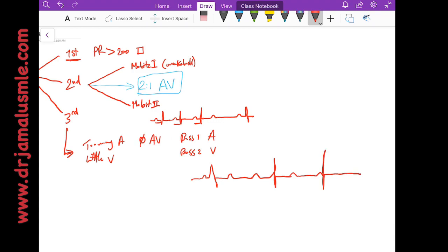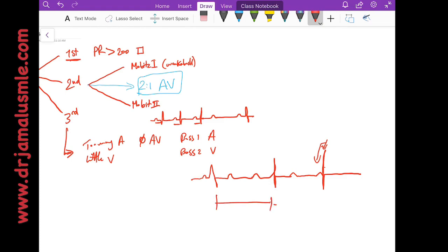This P wave, it's impossible for it to get conducted to this QRS, and this will give you the other sign that this is a third degree or a complete heart block. Also, if you have a caliper, you will see that the V's march along and the A's march along, and what we mean by that is that they have the same interval just going on and on and on again.